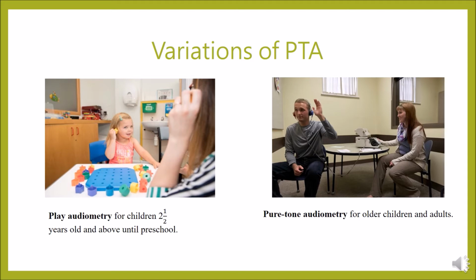As for older children and adults, pure tone audiometry is easily conducted during screening. It only requires the subject to respond either by pressing a button or raise their hand.